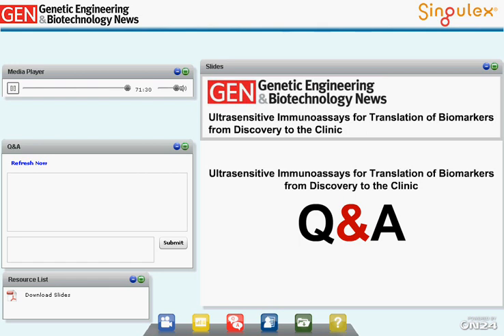By doing so, however, you have the risk to switch to platforms using different antibodies, and also we know by experience that multiplex platforms have some specificity issues. So if you're not too confident on how the panel was validated, you may end up pursuing biomarkers that may be false positives or that you would have missed because of sensitivity issues in the multiplex panel. So we definitely need more robust technologies, even for discovery, that would help alleviate these issues.